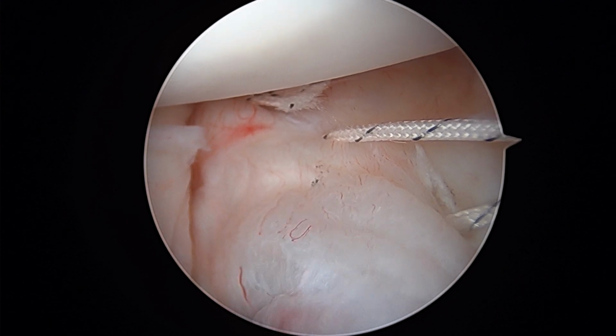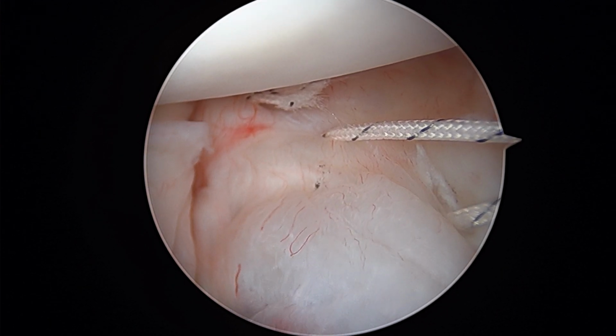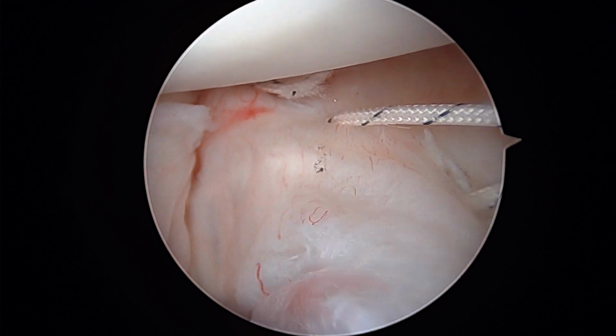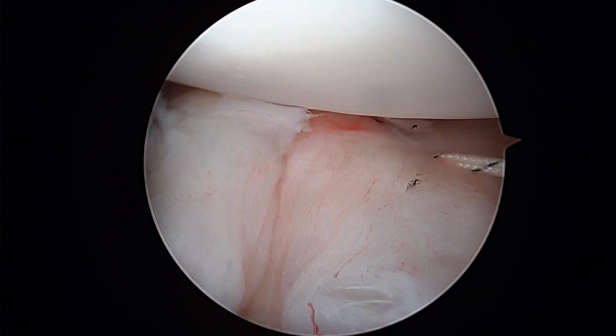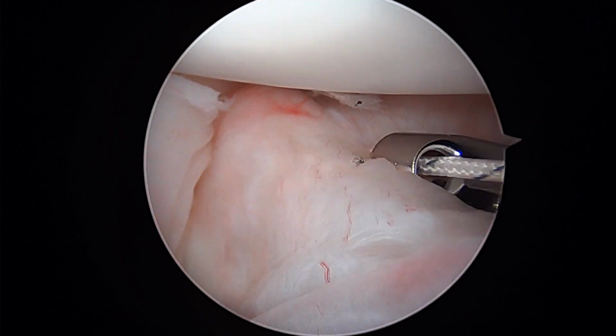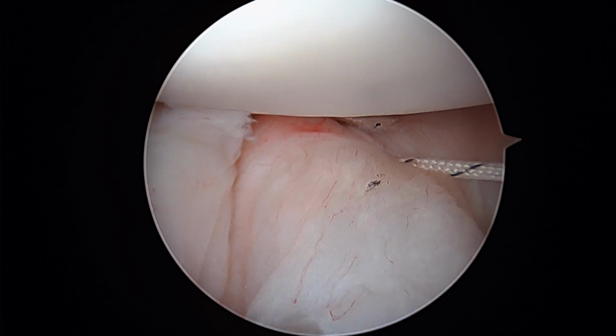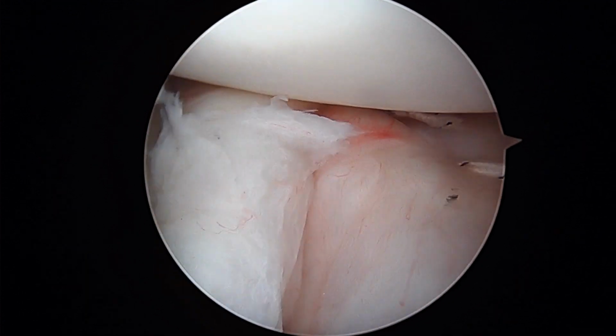Okay, here's the final mattress stitch. After this, we're done. Watch that, switch hands. But I just wanted to show you here. We're going to put our post right here because the tissue is a little more robust. We can go over what all that means in the office.